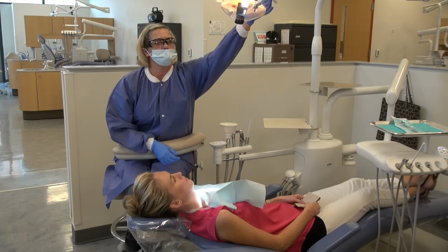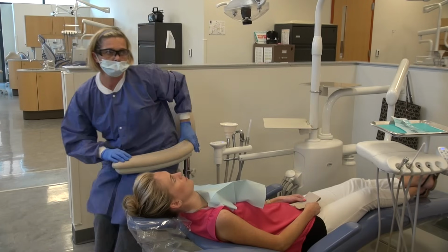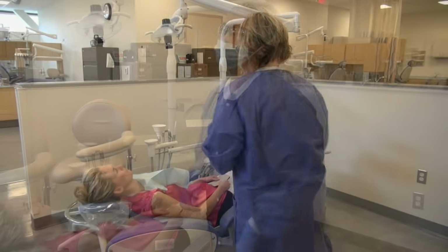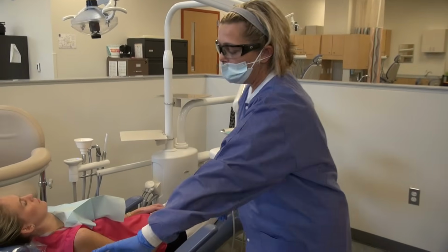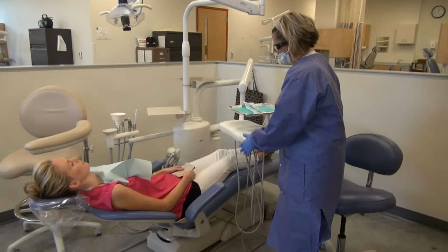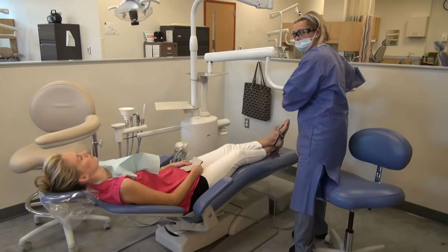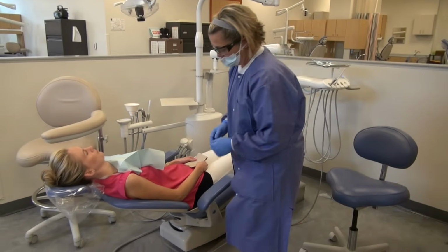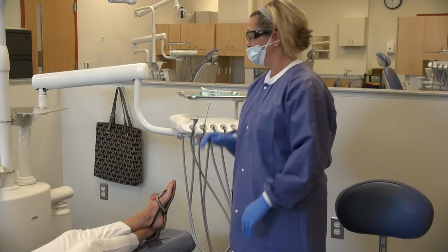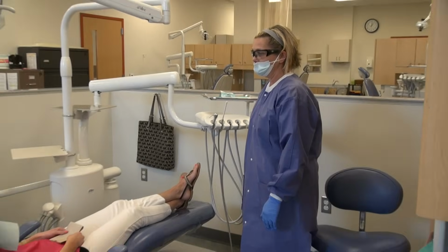Adjust the light back to the original position. Remove the operator chair. Move the bracket tray so that they don't trip on anything, and the rheostat out of the patient's way. Okay, return your patient to the upright position. I'm going to sit you up now. Ooh, sorry.